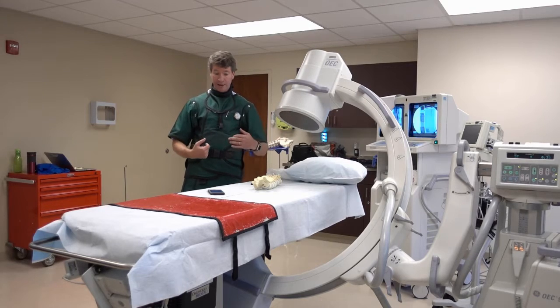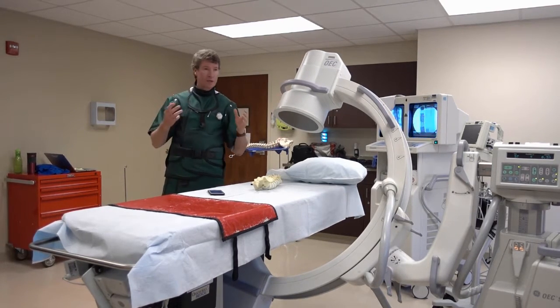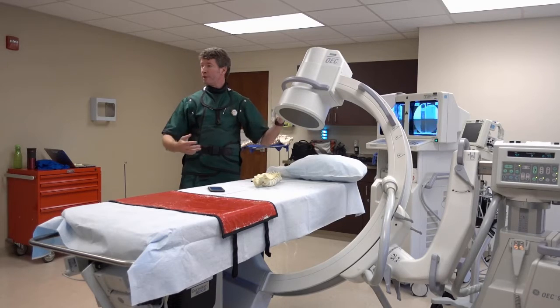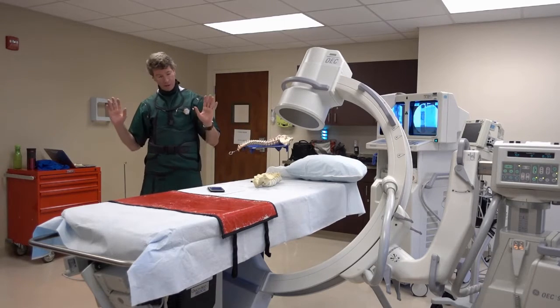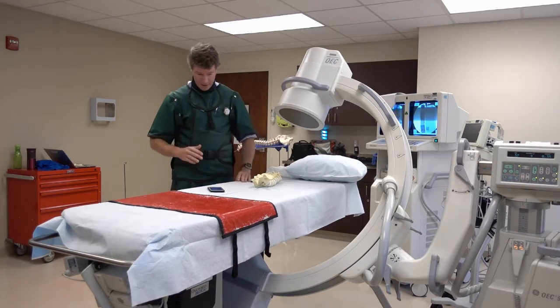Okay, so protect me. That means ask me to stand away if we're doing the lateral. Remind me. Sometimes we get so involved in the procedure, we're not thinking. You guys are thinking about this stuff. You have the ability to look at the whole picture together. So give us some clues. Hey, doc, step back, or, I'm moving this to the side. You want to come around. It's okay. Whenever you're thinking and taking care of us, we're never going to be offended, ever.